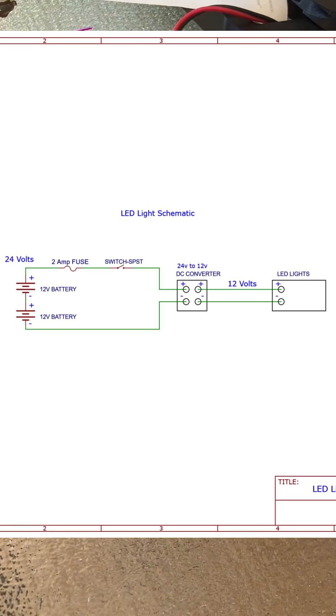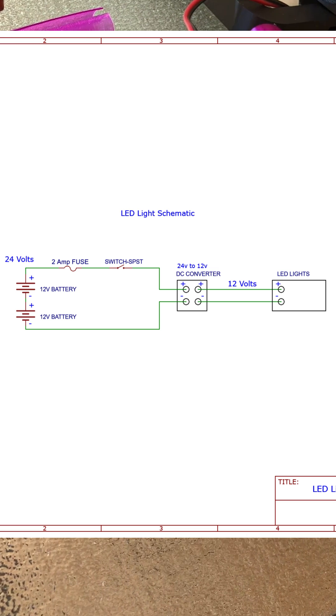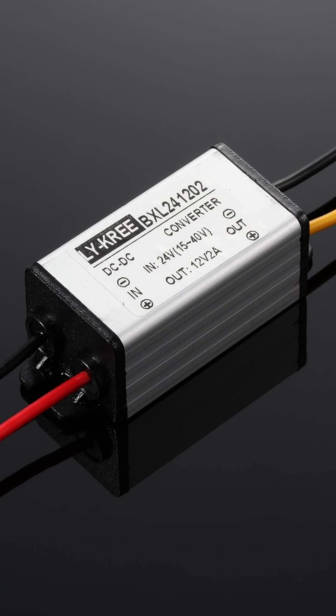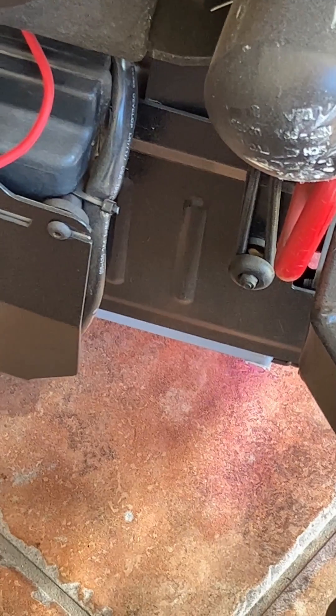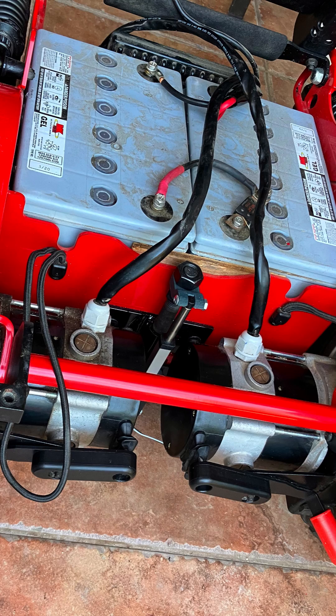Most wheelchairs operate at 24 volts, so you need a DC converter to drop the voltage down to 12 volts for the lights. You want to put the fuse as close to the battery as possible to protect the circuit.